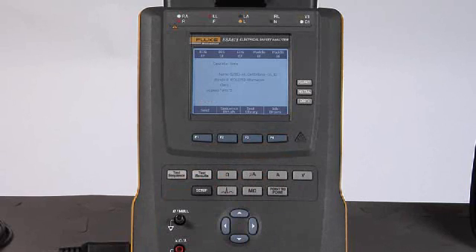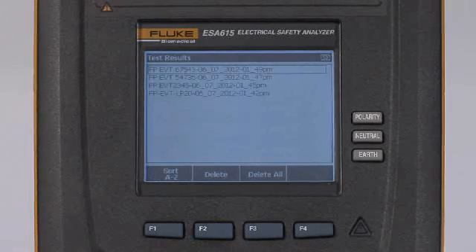The job orders button, F4, is for future use. To review test results from tests run today or during the past week, select the test results button and it will list all test results stored in onboard memory on the ESA615. The F1 button allows you to sort them alphabetically. The F2 button allows you to delete identified test results, or F3 allows you to delete all — assuming those results have been archived to another device such as your computer or have been printed out.